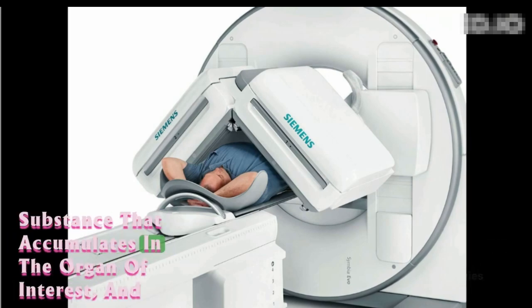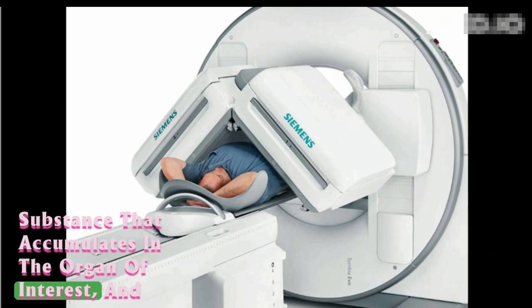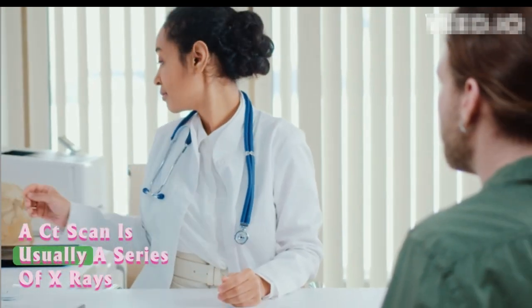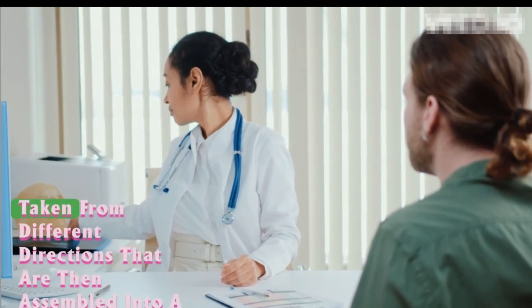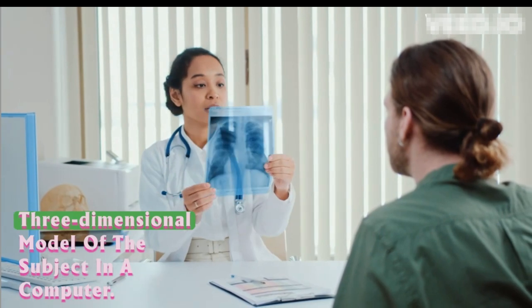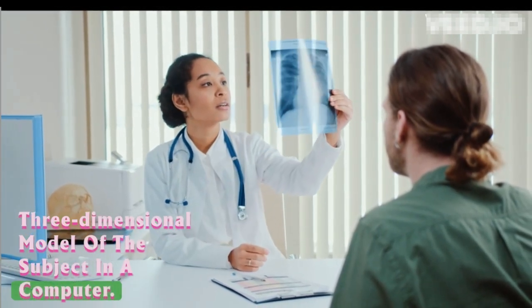A nuclear scan uses an injected gamma ray emitting substance that accumulates in the organ of interest, and a special camera records the gamma rays. A CT scan is usually a series of X-rays taken from different directions that are then assembled into a three-dimensional model of the subject in a computer.